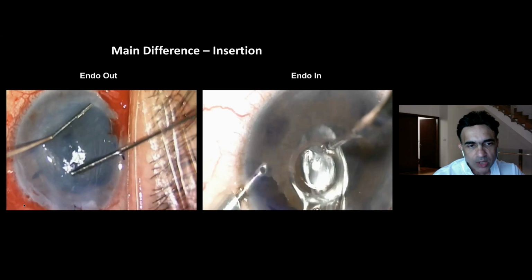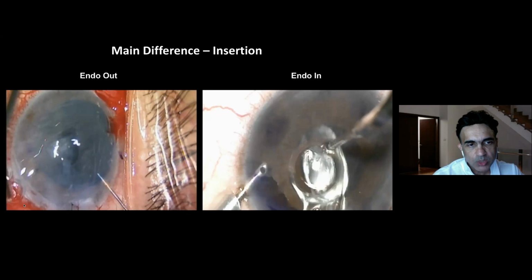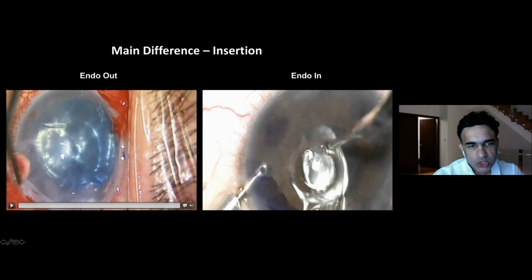I'm opening up all the graft using this short tapping. So I'm using the water currents inside the eye to get the placement of the graft. You can see how shallow the anterior chamber is. This is a patient with CMV endotheliitis. That's why the cornea is so hazy. But once the graft is open, I put the gas bubble underneath the graft itself, and the graft is into position. This little marker over here is what we call an asymmetric marker, and that's my preferred choice to help me with the orientation.